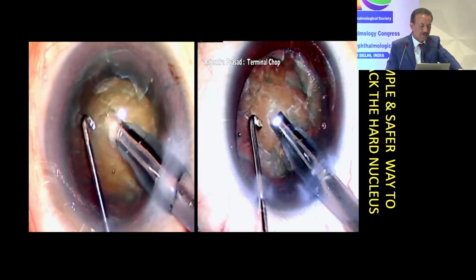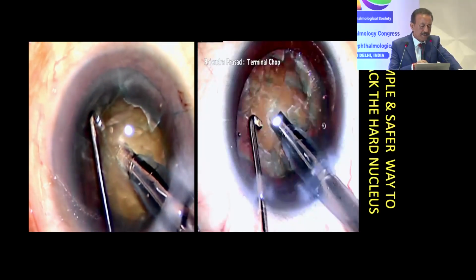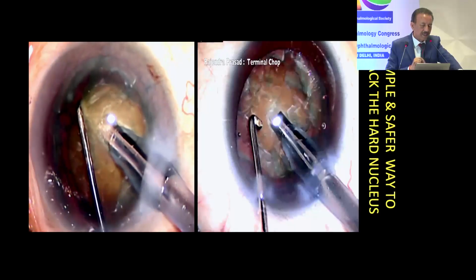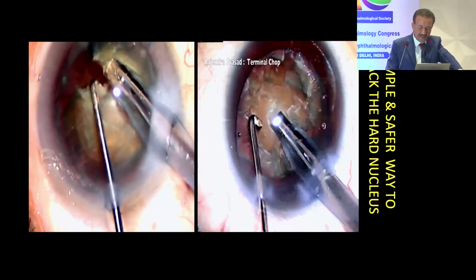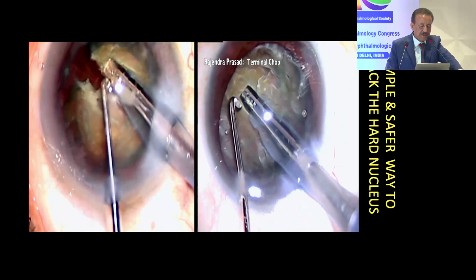And you can see these are other cases, where you have a very, very hard nucleus. I'm just trying to hold it just within the equator, slightly draw it, go around, hook it, and then see the crack happens here at the equator. Then you have to slightly split it, and you get a complete, full thickness cracking of the nucleus.